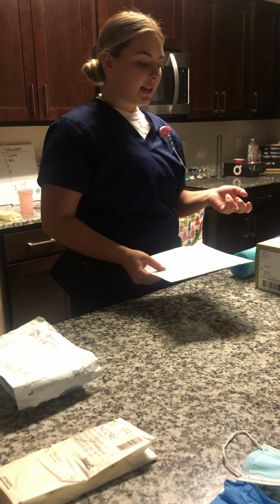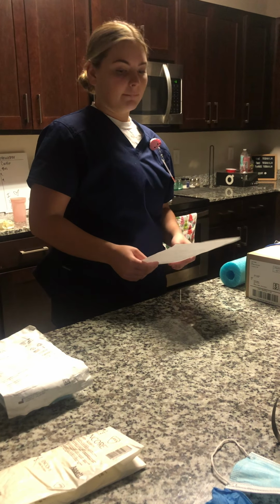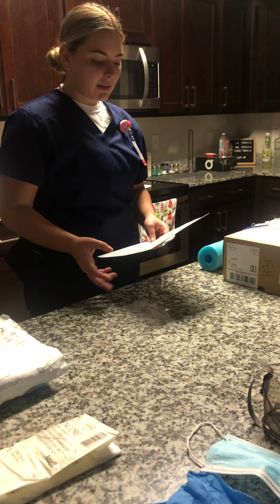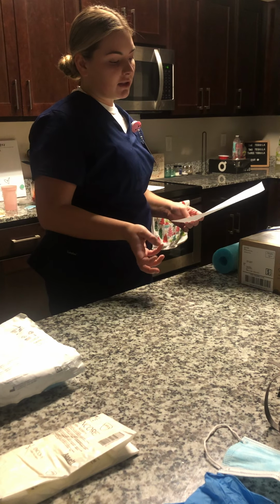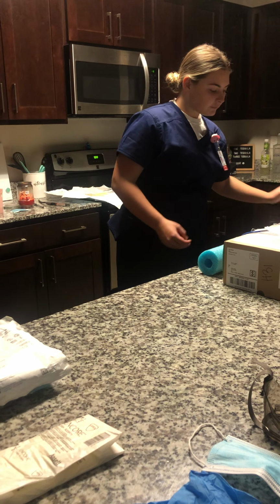I also see that he has an allergy to penicillin. Are there any other allergies we need to be aware about? So he has no other allergies that we need to be aware about. I explained the procedure to him. So now I'm going to set the care order form right here.